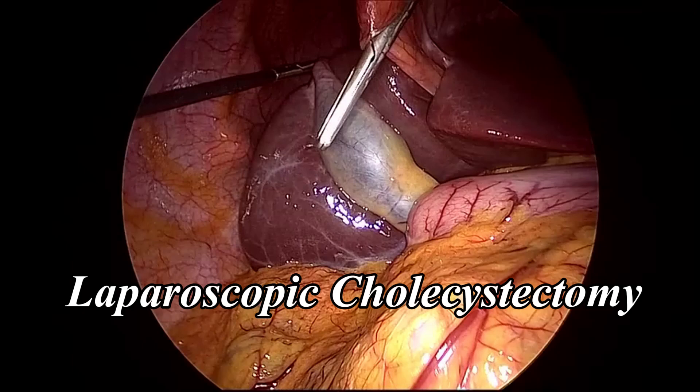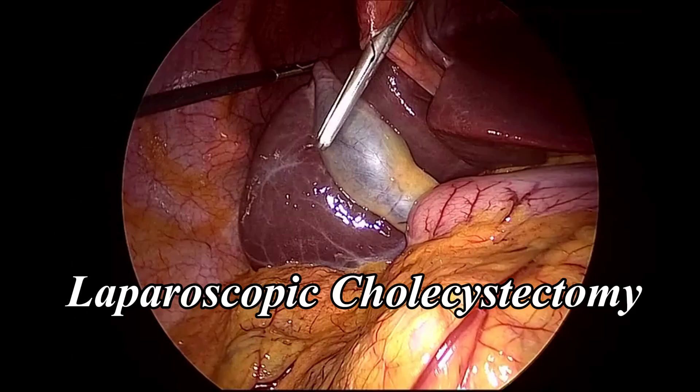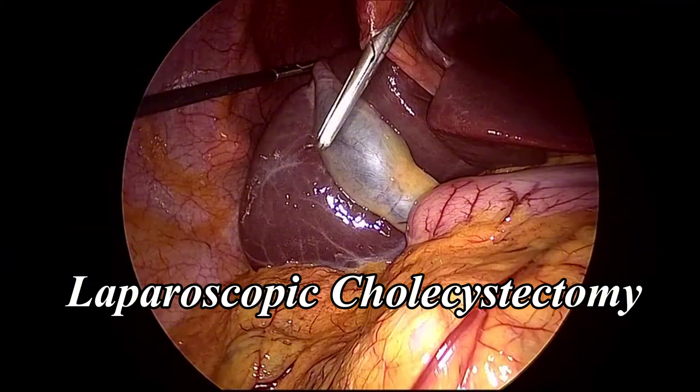Welcome back to Ellie Scrubs In. Today we're walking through a laparoscopic cholecystectomy, a minimally invasive removal of the gallbladder most commonly performed for symptomatic cholelithiasis or acute cholecystitis. This narrated walkthrough covers the key steps of the procedure, what instruments are used, and important pearls and pitfalls to remember.